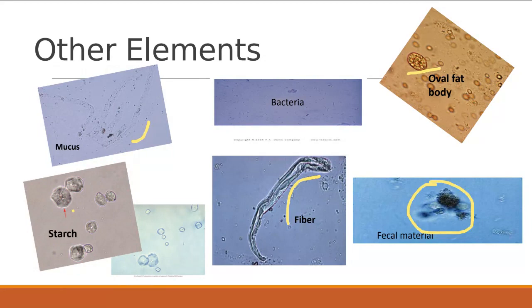That's not something you'll have to call. You would have to call things like bacteria. But other than the bacteria, you're not really going to call these other ones typically. If we saw them in lab, you can note on your paper that they're there, but bacteria is pretty much the only thing that can be significant. These other ones are just things that made it into the urine, some type of contaminant.